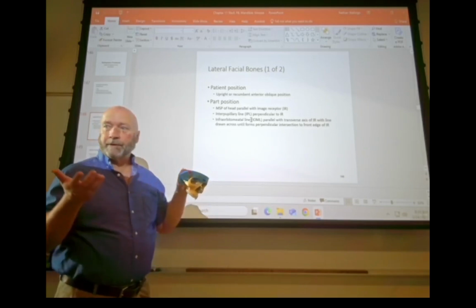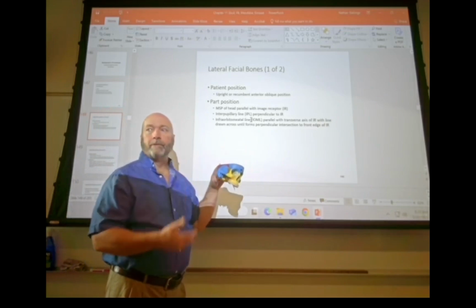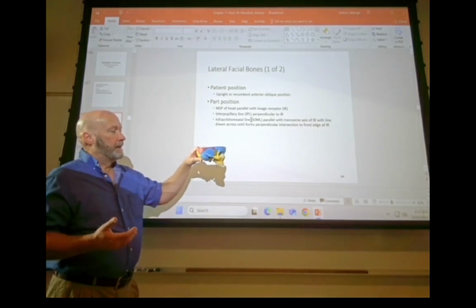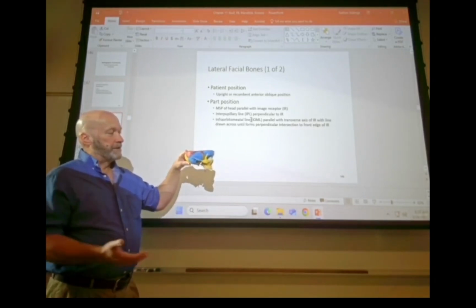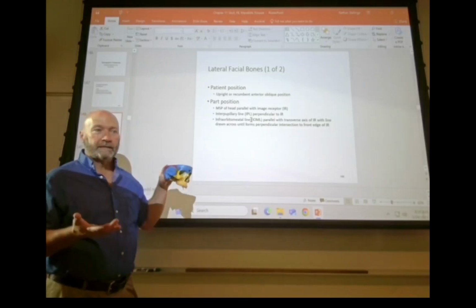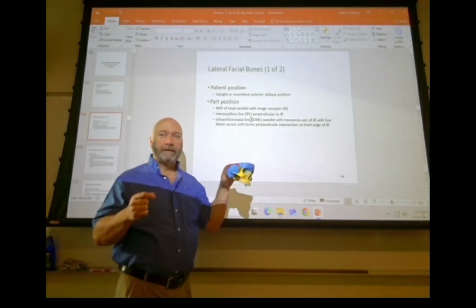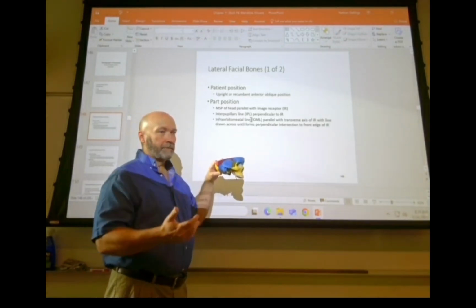May have to build up the patient's chest, may have to build up the patient's head, may have to shoot cross table. If the patient's upright, it alleviates some of that. So use your discretion. Again, if the patient took a pretty good lick to the face, they may be a little punchy. It might not be a good idea to stand them up. So use some discretion.